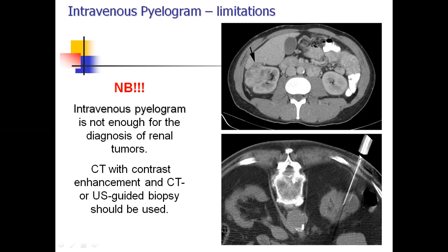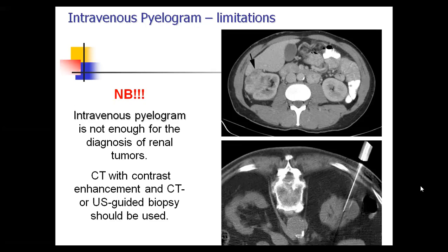A needle is inserted into the area of our interest under CT control, and when we ensure that the needle is placed correctly, we take samples for cytological or morphological examination, so we have a chance to confirm the diagnosis morphologically.